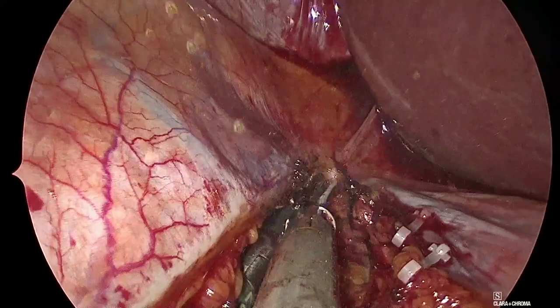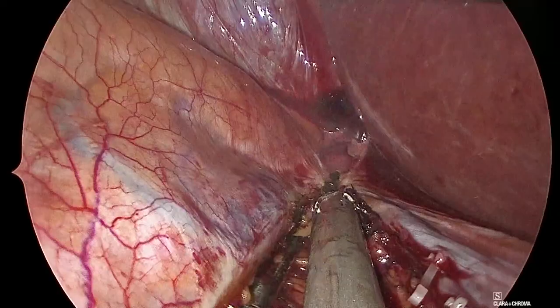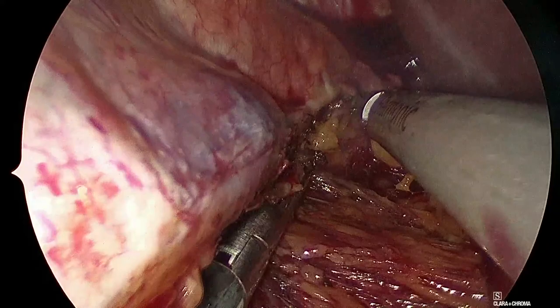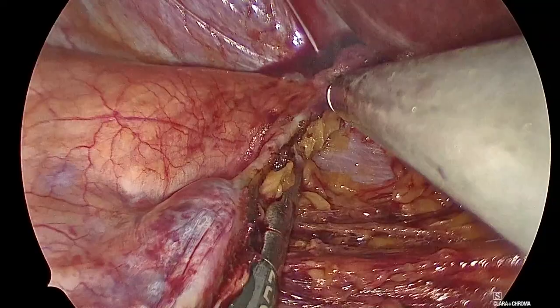Don't worry. So here we have the plane between the adrenal gland and the kidney itself. So we will use this low button here, so it will seal the vessels. Come closer, Luis. So the strategy that I use always in kidney surgery is to access the upper pole and to have all my upper pole free up until I see the psoas muscle. Okay, like in this situation.